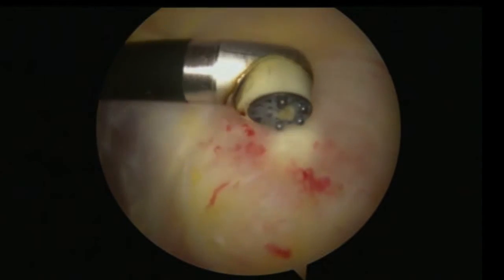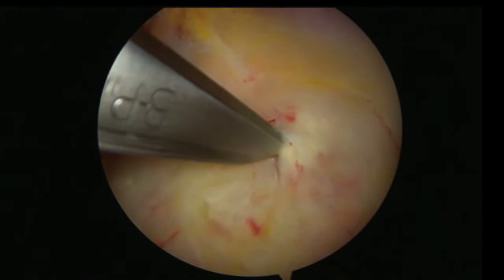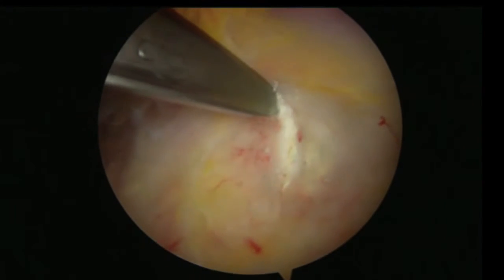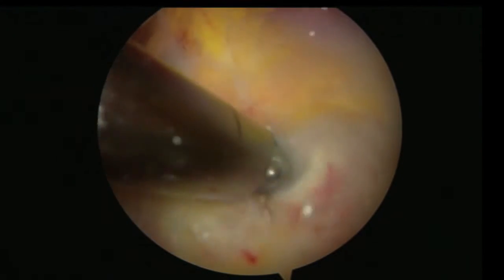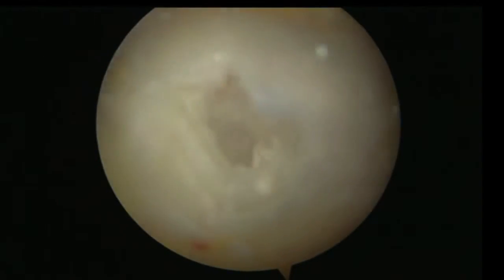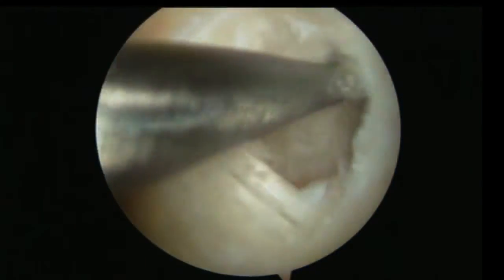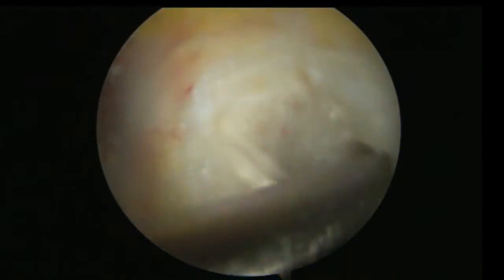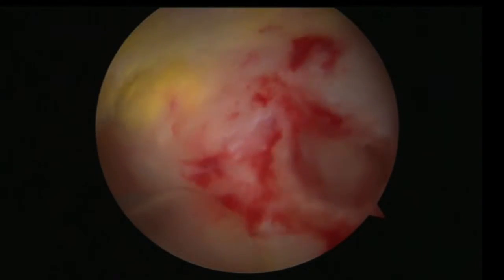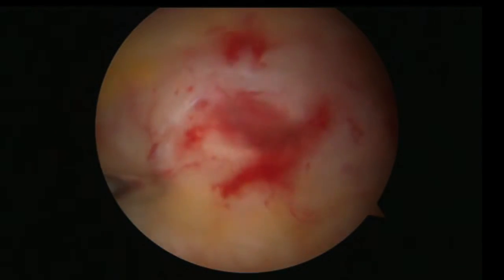With the scope in the anterolateral portal of the right shoulder, a radiofrequency probe is inserted via the posterior portal to remove the subacromial bursa and identify the region of calcification. An 11-blade knife is inserted through the rotator cuff tendon in a longitudinal fashion to allow for excision of the chalky white calcium deposits. An arthroscopic shaver is then inserted into the supraspinatus tendon and the calcium deposits are removed from within the tendon. A curette and shaver are used to ensure that all calcific deposits are removed from within the tendon and subacromial space. It is important to copiously lavage the joint of all calcium deposits, as leaving calcium in the joint increases the risk of post-operative stiffness and adhesive capsulitis. Following excision, a small but complete full-thickness tear of the supraspinatus tendon remained. The majority of the footprint on the greater tuberosity was left intact, and therefore the decision was made to perform a side-to-side repair of the interstitial split of the supraspinatus tendon.